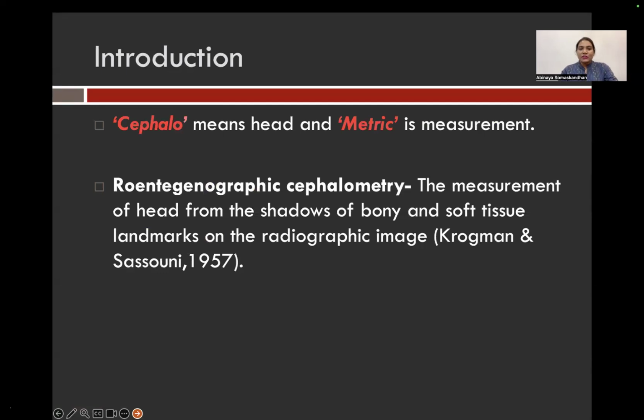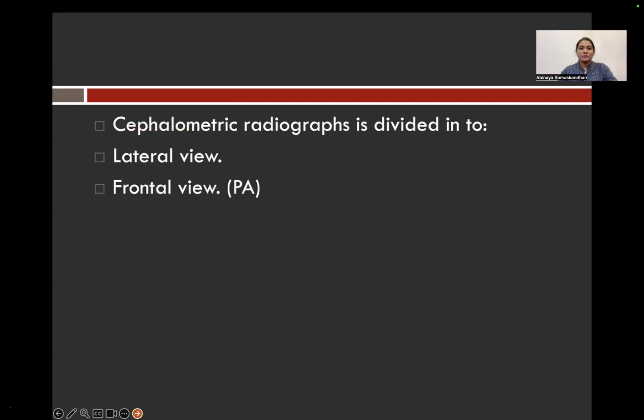So basically, cephalo means head and metric is measurement. And röntgenographic cephalometry, which we are using in ortho, is the measurement of the head from the shadows of bony and soft tissue landmarks on the radiographic image.